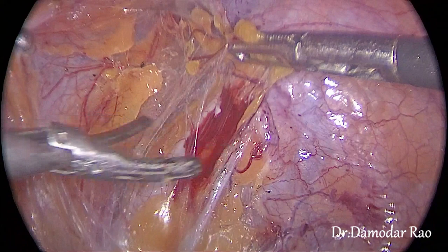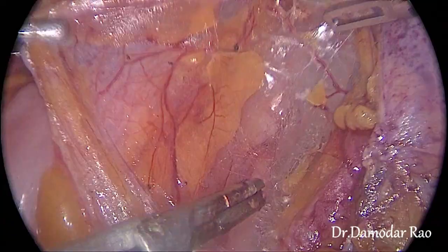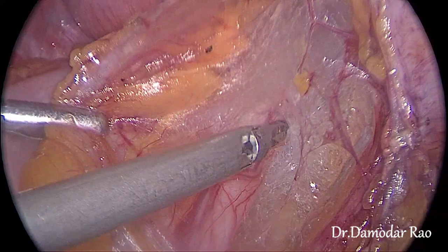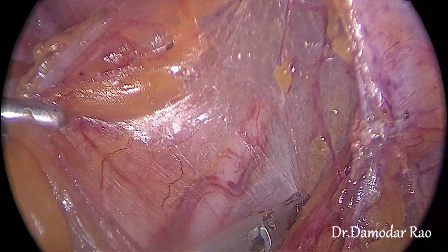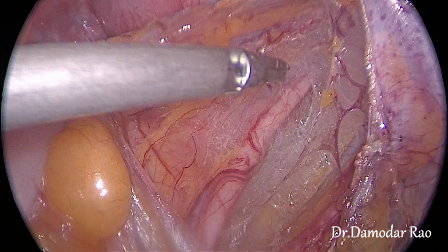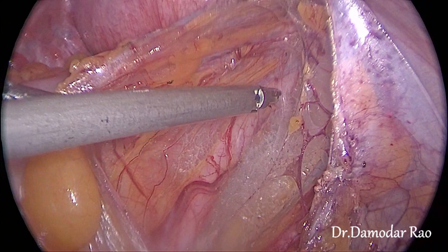Just as we cut the transverse fibers we come across some bleeding. Bleeding should be arrested immediately, otherwise it stains the tissue and dissection can be difficult. With medial pull on the IP ligament the ureter becomes exposed. You can see the ureter with its mesentery and its own blood supply, which should not be disturbed. Push on the lateral surface of the ureter until you come across resistance. If there is resistance, do not push but cut the tissues, as pushing against resistance may cause bleeding and staining.